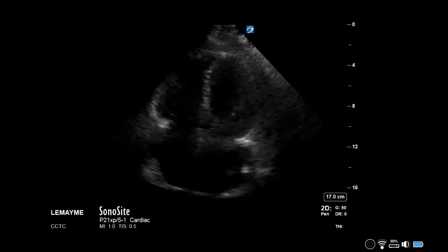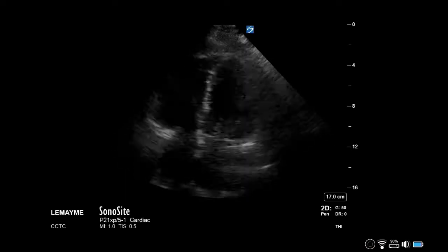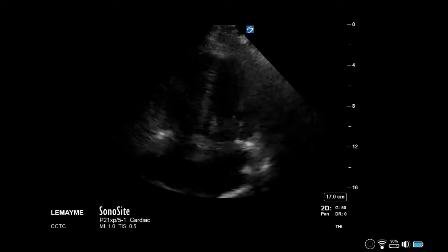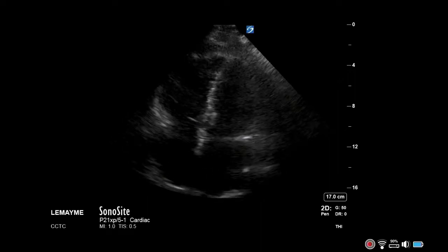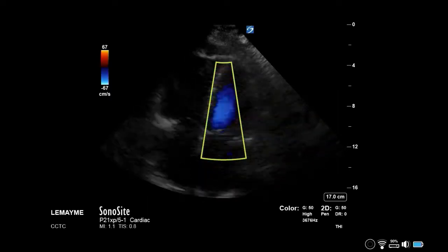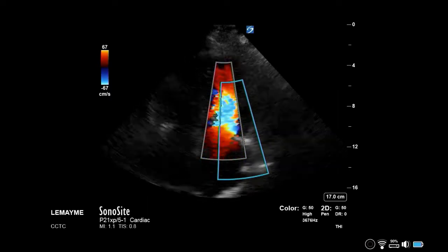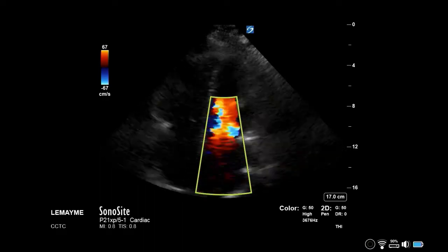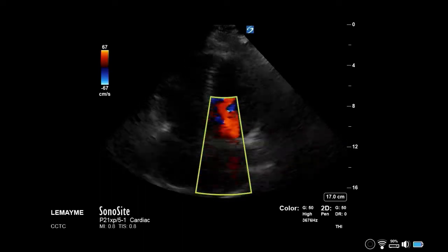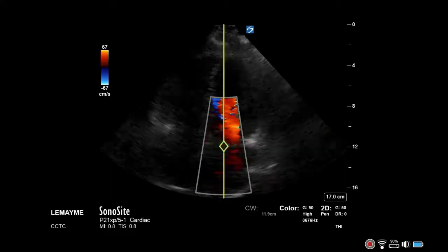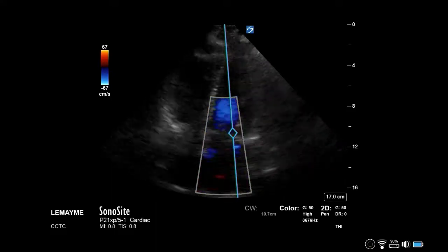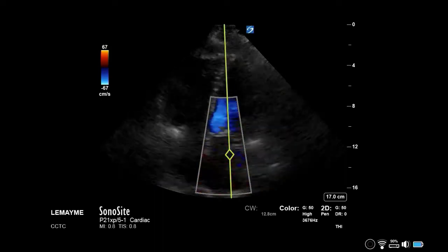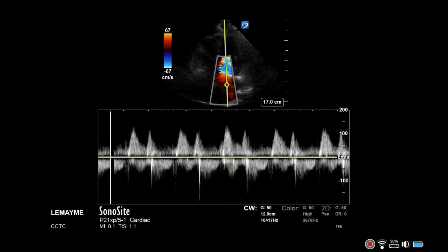Pressure halftime and deceleration time can be used to calculate mitral valve area. Begin by obtaining an apical 4-chamber view and place a colour box over the mitral valve, including the atria and the inflow. Use continuous wave Doppler and place this parallel to the inflow jet. This will obtain the tracing at the bottom of the screen.